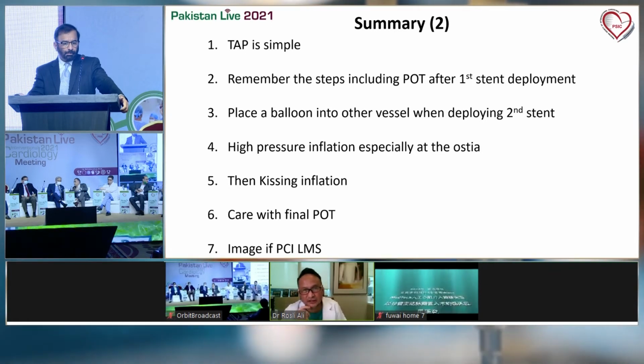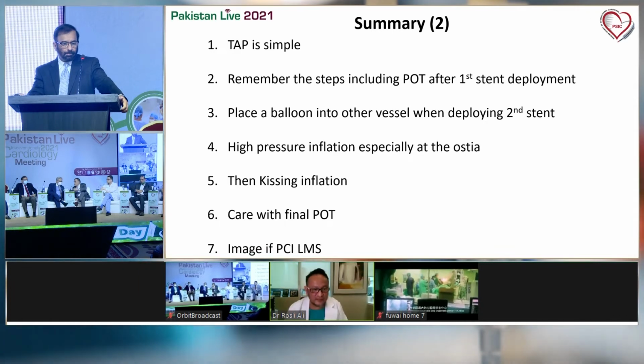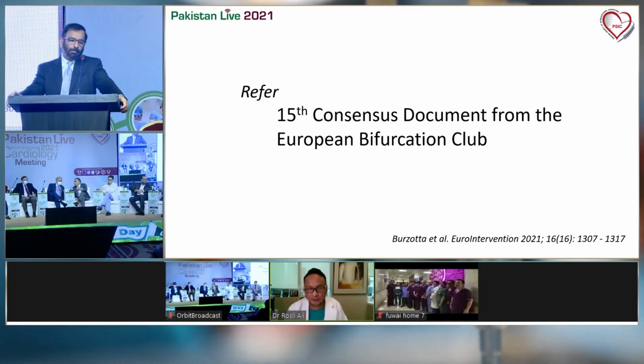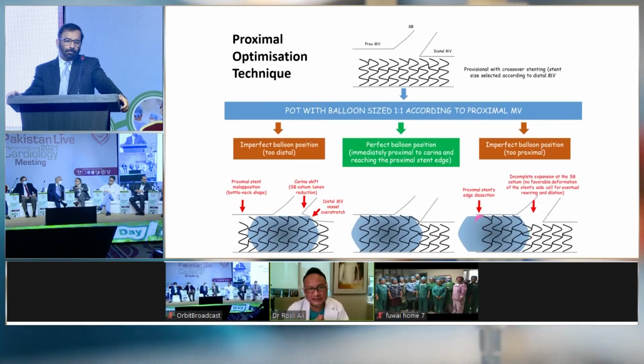And for PCI, remember to image, and this is very important because the outcome depends on the left main stem, rather, on how well the stent is expanded. Left main, image them. Finally, just to refer to the European Bifurcation Club.